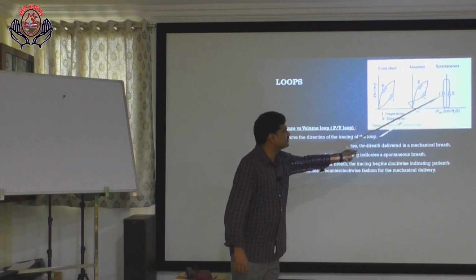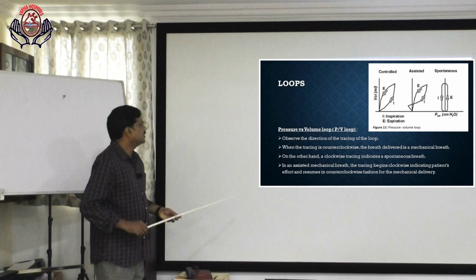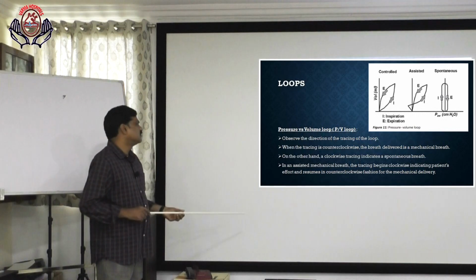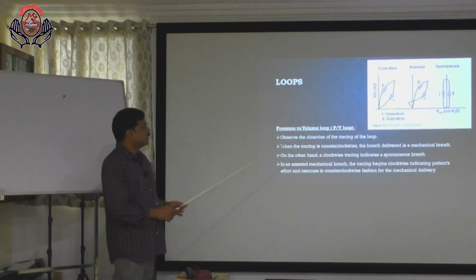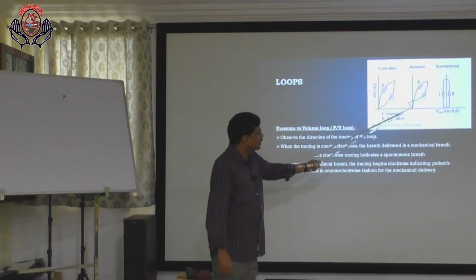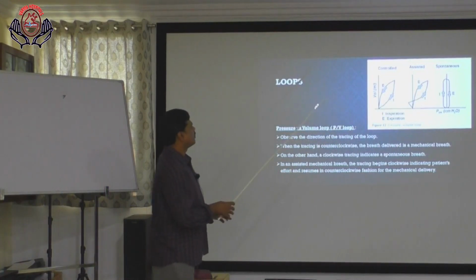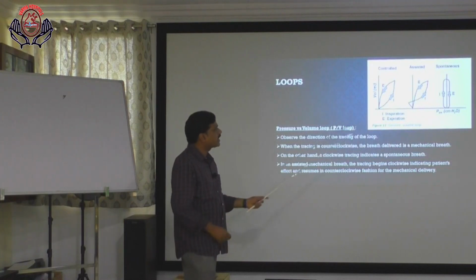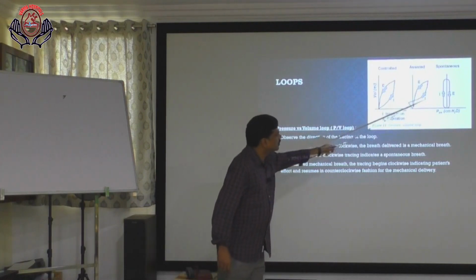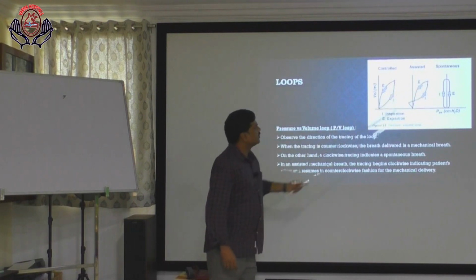During inspiration, the spontaneous breath traces clockwise. In an assisted mechanical breath, the tracing begins clockwise, which indicates the patient's effort, a spontaneous breath, and then resumes in a counterclockwise direction for the mechanical delivery.